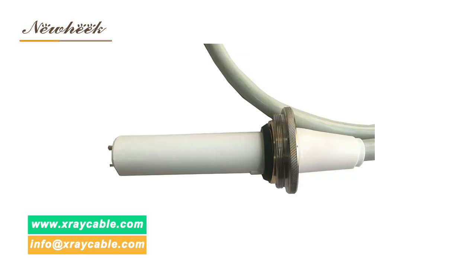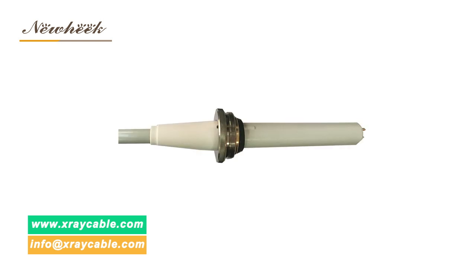Regarding cable length, Nuheek can customize different lengths according to customer needs. Nuheek's high voltage cables are usually available in 2 m, 4 m, 6 m, 8 m, 12 m, 15 m, and 20 m lengths.